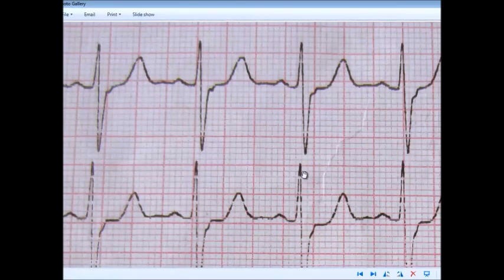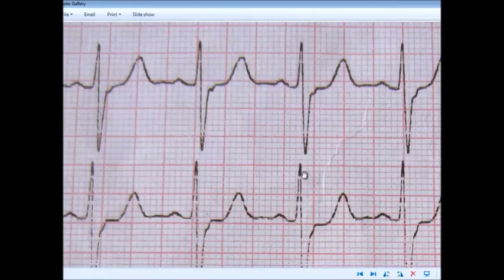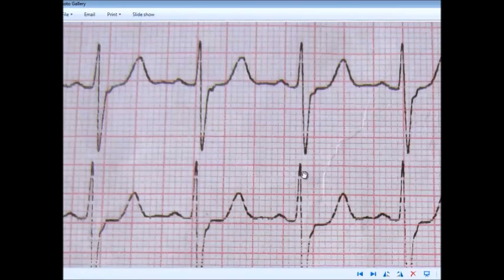Since this ECG runs at 25 mm per second, we multiply 18 by 0.04, which gives 0.72. Then 60 divided by 0.72 equals 83.33 — the same result as our first method, approximately 83 or 84 beats per minute.